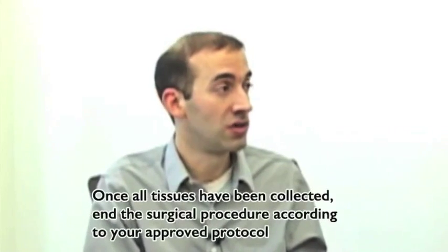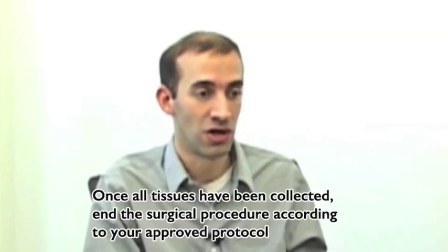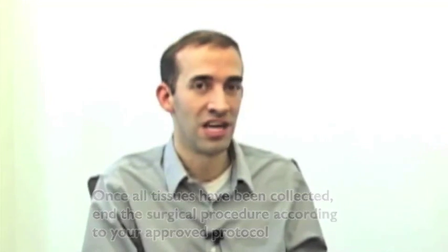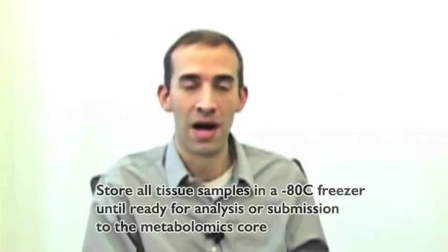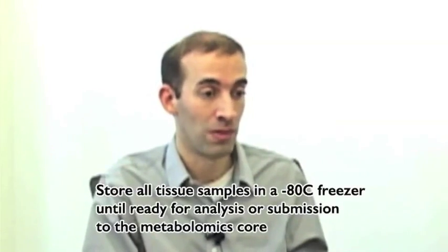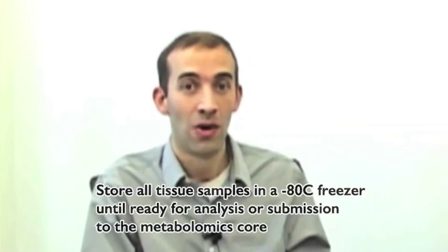Once all the tissues that you're interested in have been collected, you can end the procedure according to your approved animal protocol. Store the tissue samples at -80 degrees C or colder. For sample preparation steps that come next, see the Metabolomics Core website. We have a video on that topic, or consult with the Metabolomics Core.